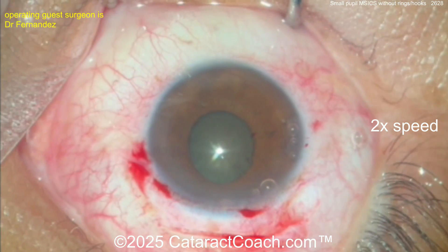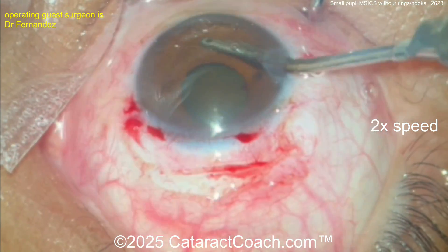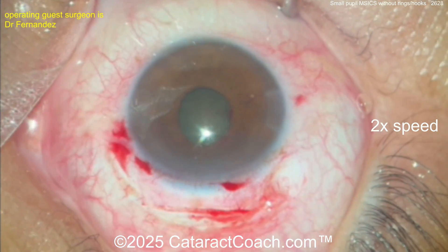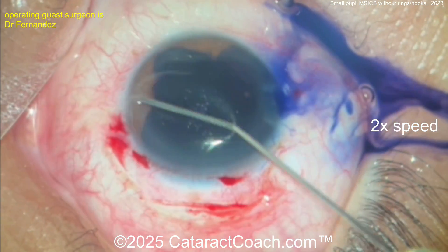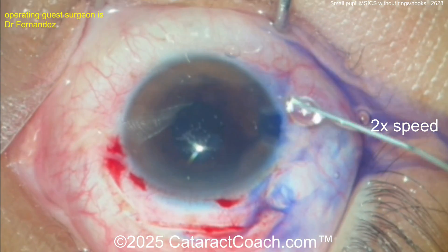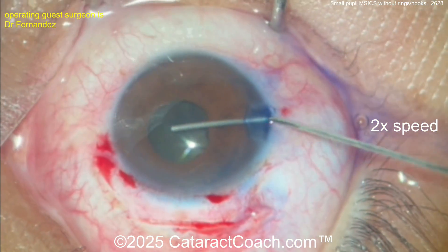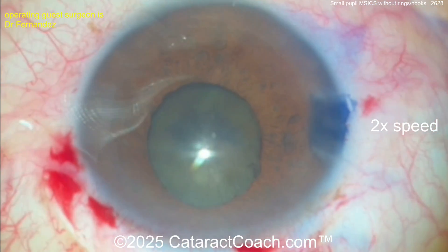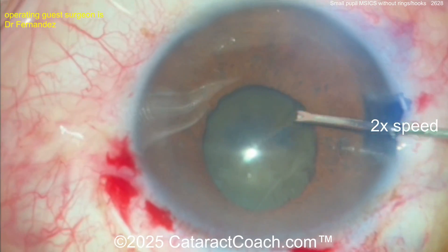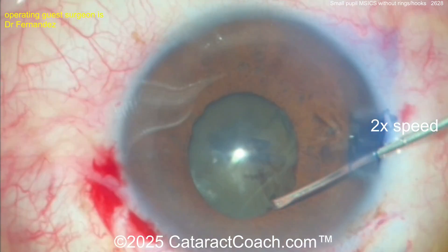As long as you can get a five millimeter capsular rhexis you're going to be good. It's not too dense of a cataract — a reasonable cataract here. The surgeon is removing the viscoelastic because of trypan blue dye. If you use HPMC, it will prevent the trypan blue dye from staying in the capsule, so you may want to put a little aliquot of trypan blue under the iris to get full staining of the capsule.